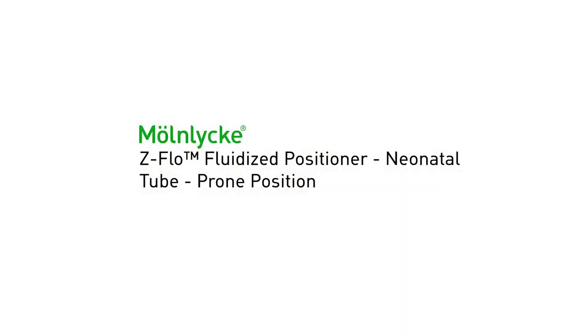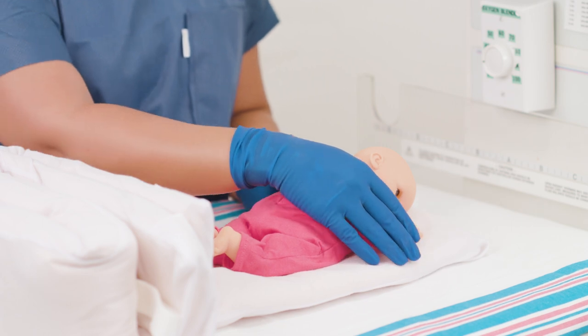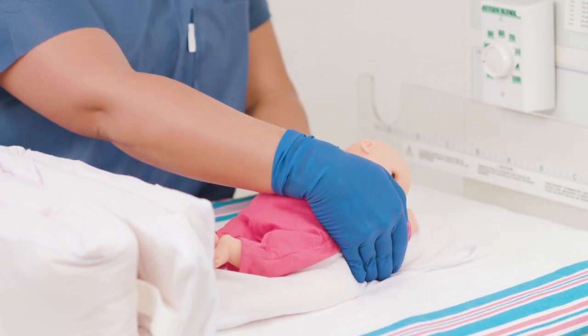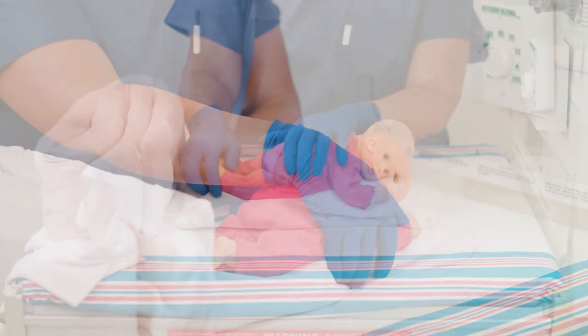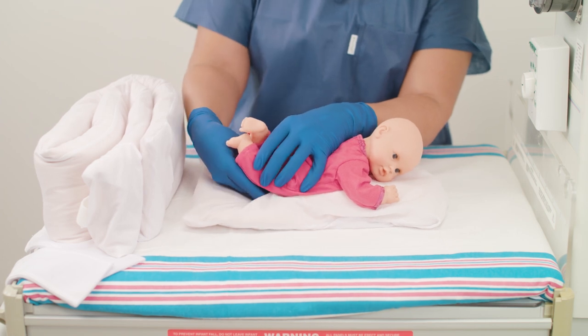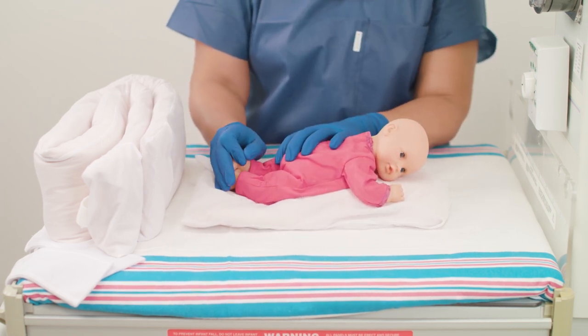To position the baby in a prone position, begin with the small, flat positioner on the bed. Create a mound down the center of the positioner to support the infant. Place the baby on the mound, ensuring the neck and head are properly supported on the positioner. Make an indentation for the baby's knees and mold the sides around the body.